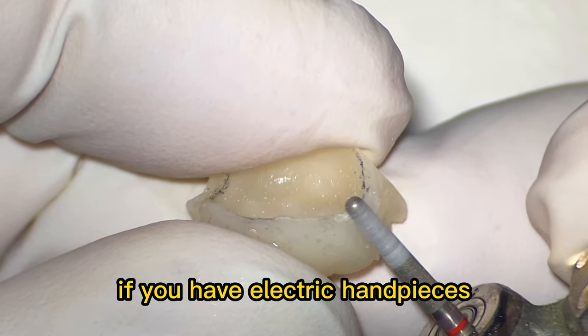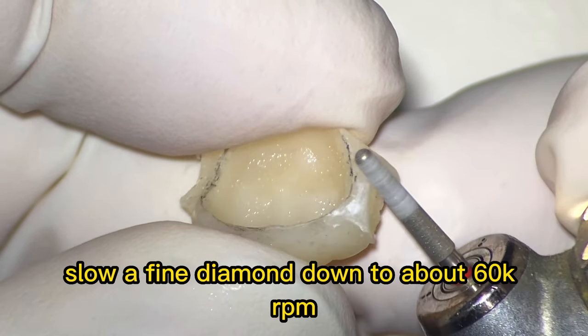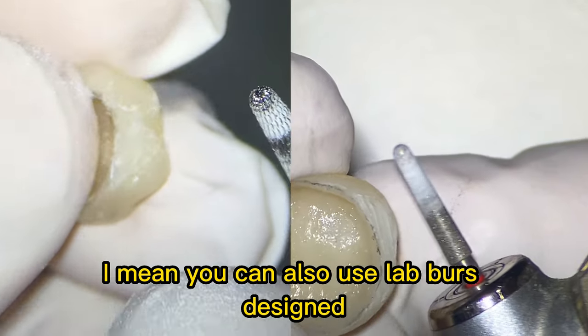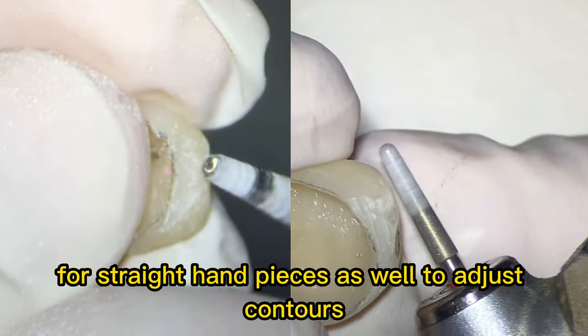Tip number five: if you have electric handpieces, slow a fine diamond down to about 60,000 RPM. You can also use lab burrs designed for straight handpieces to adjust contours as well.